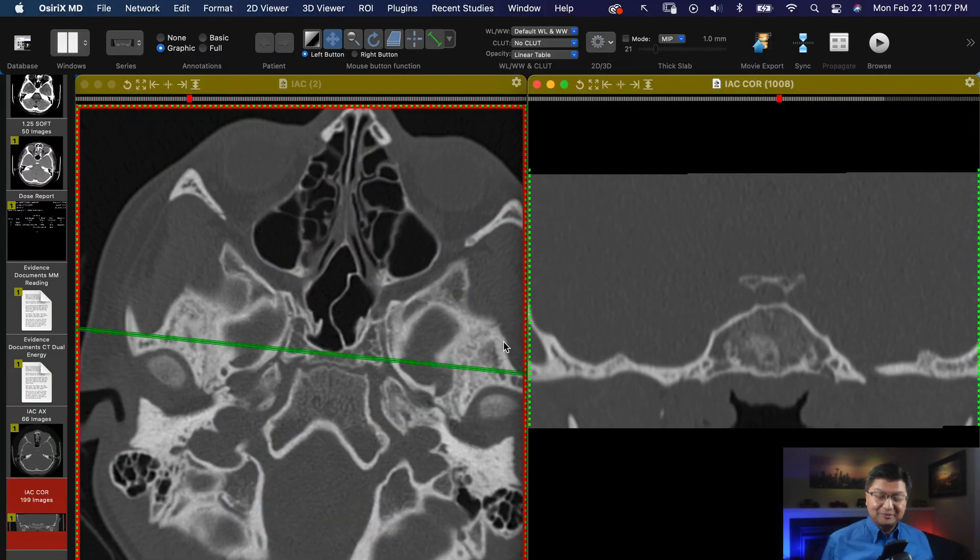Hi, I'm Mahesh Thapa and today we're going to talk about the pterygopalatine fossa as seen on CT scan. There are seven entrances and exits to the pterygopalatine fossa and I want to show you a relatively easy way to find most of them, if not all of them. Let's get started.